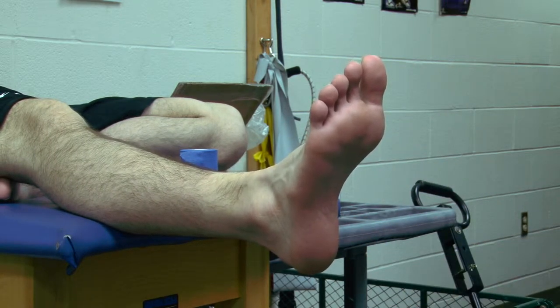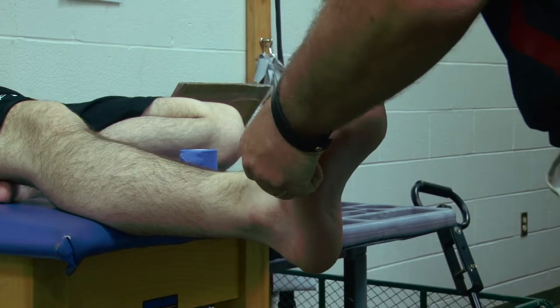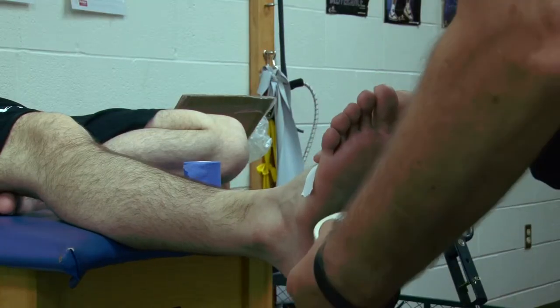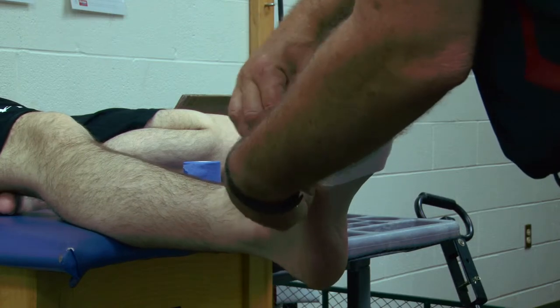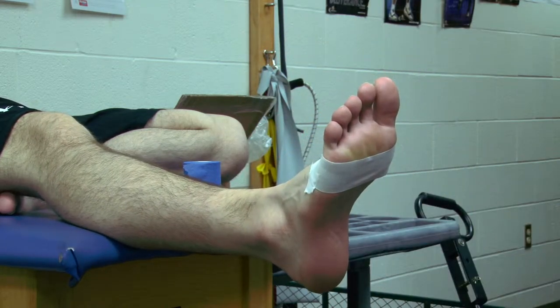First thing we're going to do, as always, is apply our anchors. We're going to apply one anchor around the metatarsal heads, just nice and lightly. There's no tension on this whatsoever — it's just a place for the tape to hold.